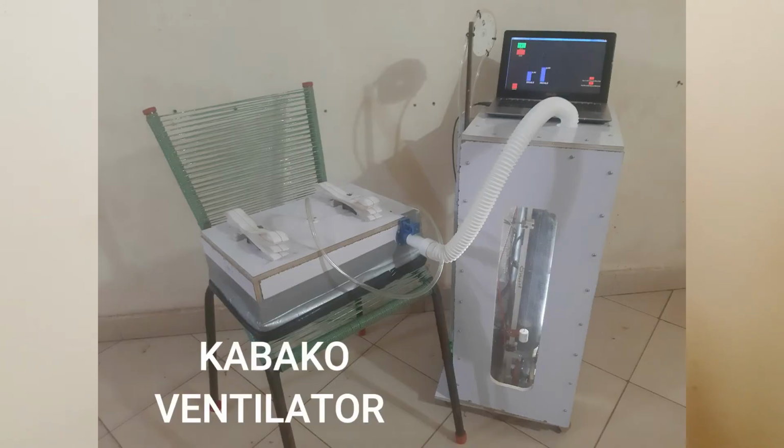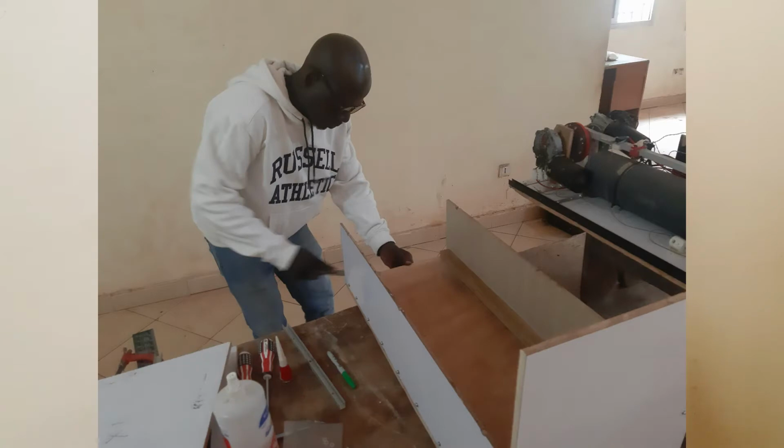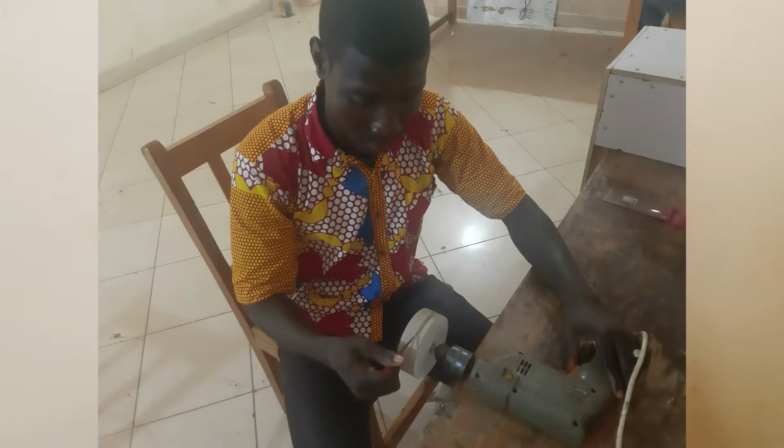We have built a COVID ventilator in Africa for use in Africa and other developing parts of the world. We call it the Kabako Ventilator. Our ventilator design is ideal for developing countries because it can be built from local parts and it can be built by virtually anyone using simple tools.